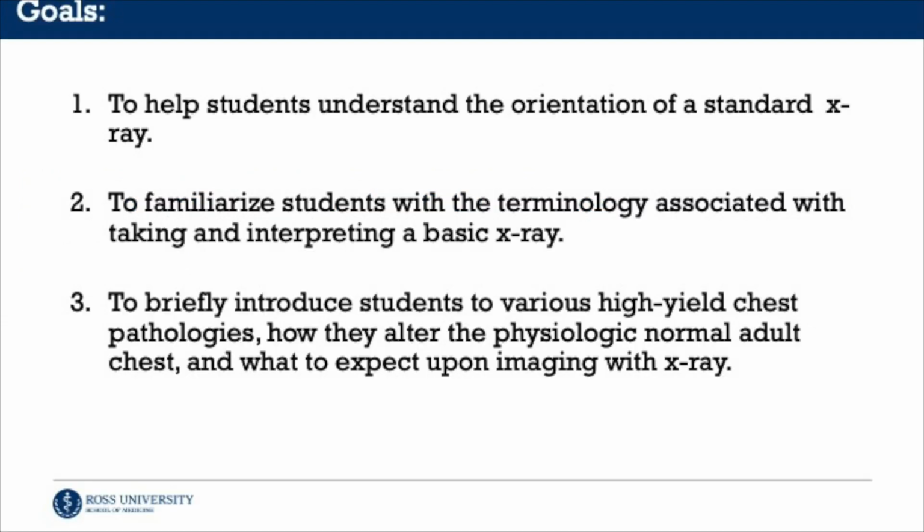Let's take a look at our goals. Our goals are to help the students understand the orientation of a standard X-ray, to familiarize students with the terminology associated with taking and interpreting a basic X-ray, and to briefly introduce students to various high-yield chest pathologies, how they alter the physiologic normal adult chest, and what to expect upon imaging with an X-ray.